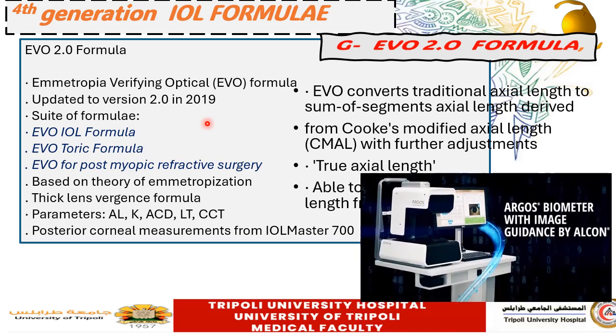So this EVO formula is a suite of formulas that utilizes the same principle of emmetropization, but with different tasks for traditional IOL, toric IOL, and for post-LASIK ablation cases.